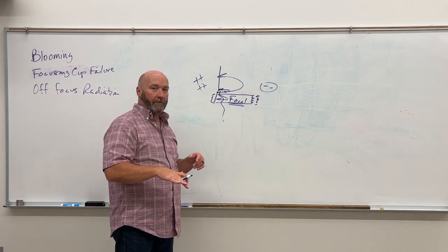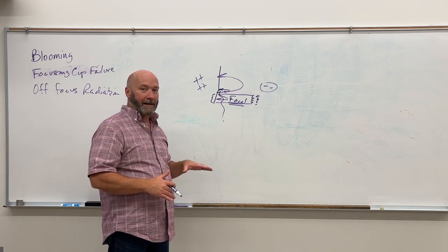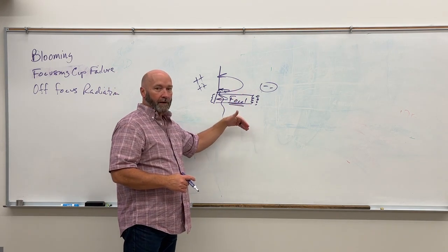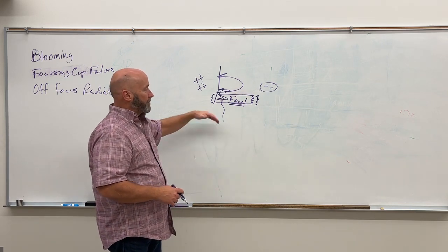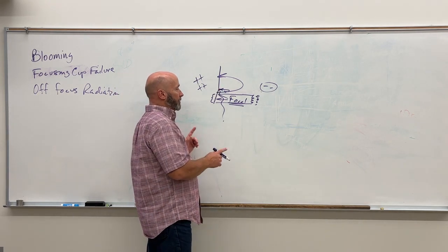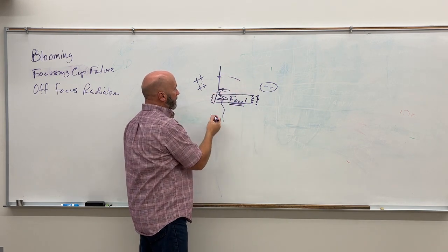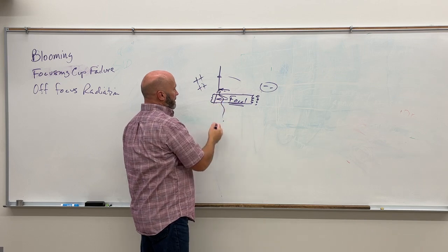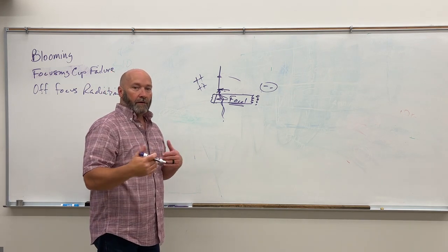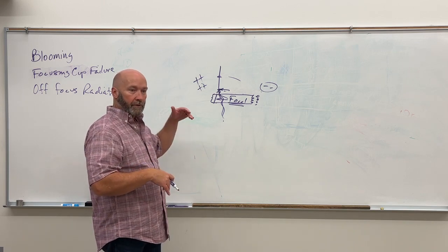Scatter radiation is secondary radiation that comes through the patient. Off-focus radiation is primary radiation because it has not interacted with the patient yet, but it's created somewhere aside from where we want it to be created. The problem with off-focus radiation is, take this one photon that we created here. If this controls our sharpness of recorded detail, creating another X-ray photon up there decreases our sharpness of recorded detail. So off-focus radiation reduces sharpness of recorded detail. Spatial resolution suffers from off-focus radiation.